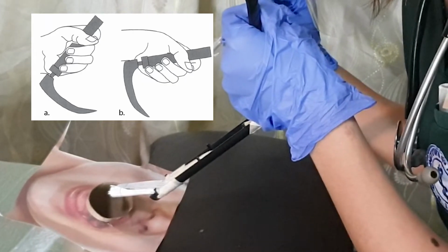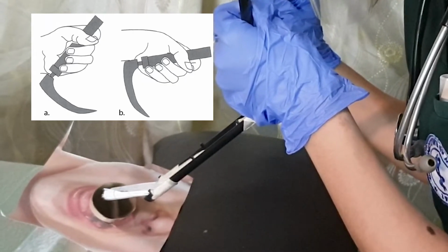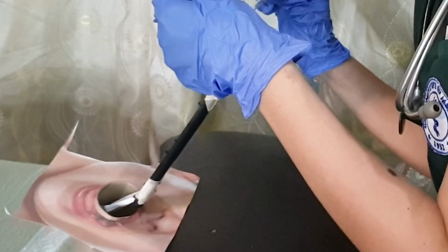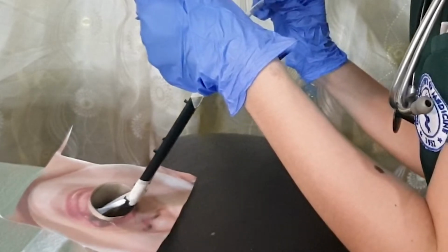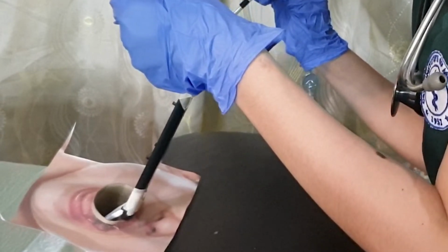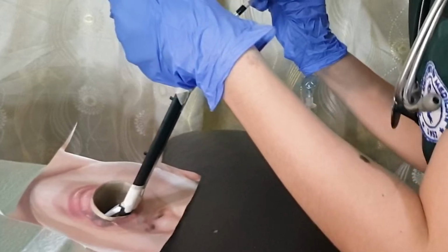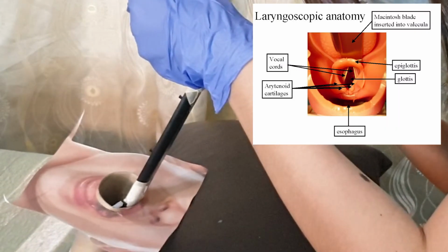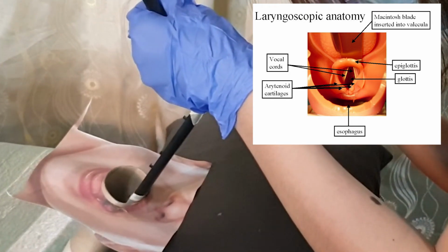Hold the laryngoscope using the left hand with the 5th finger close to the hinge and the handle pointing right to the sagittal plane. Introduce the blade along the right margin of the tongue, displacing it towards the left. Advance the blade until the right tonsillar fossa is identified. Medial to the tonsillar fossa, locate the epiglottis. Advance the blade to the midline glossoepiglottic reflection.